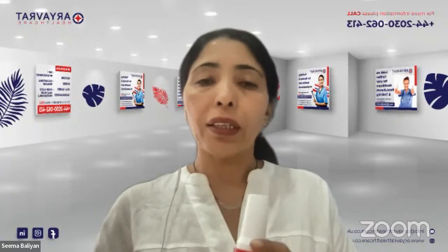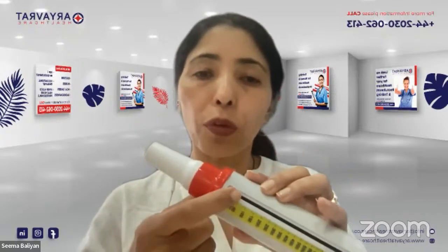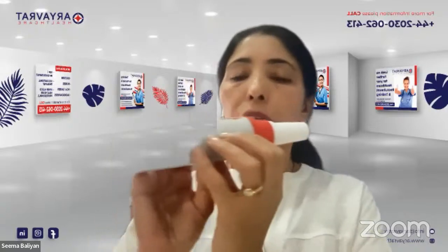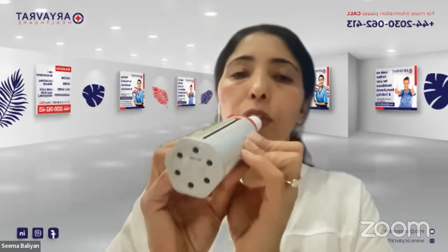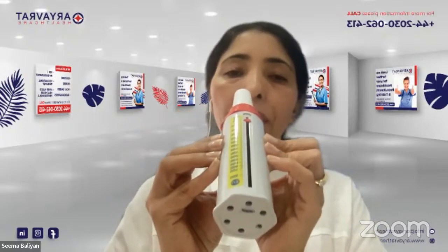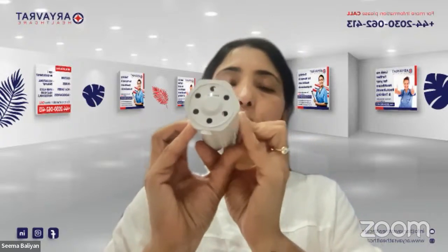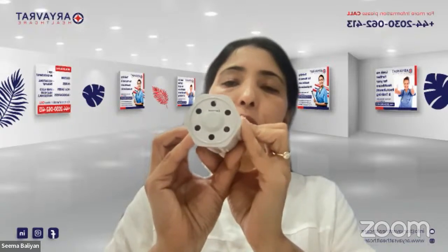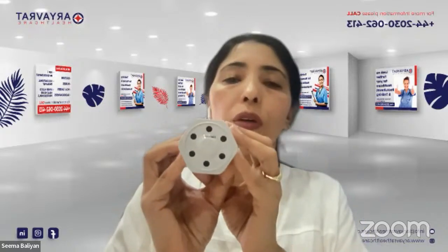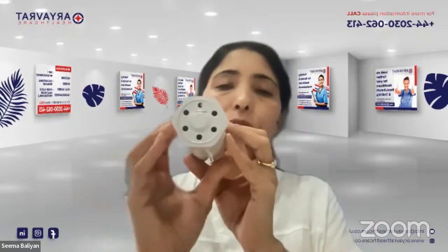Once you have gained this position, you are also going to make sure that your plunger, before you measure, is on 0, and that you are holding your peak flow in such a way that you are not blocking the plunger. So you hold it in this way so that my fingers are not blocking the plunger, and I keep it in a horizontal position, because I do not want gravity to have any effect. So I'll keep it horizontal, parallel to the floor.